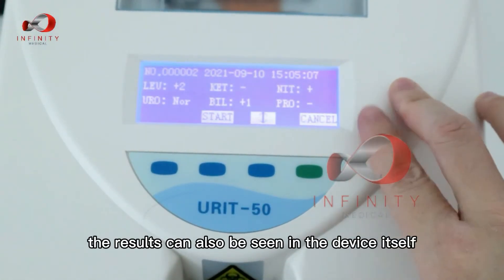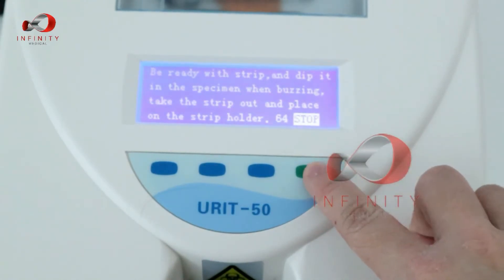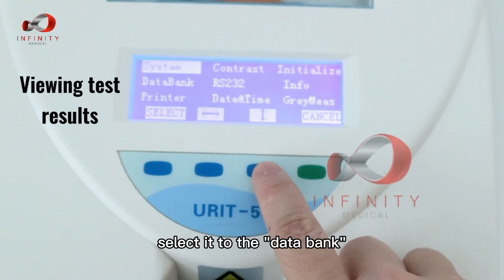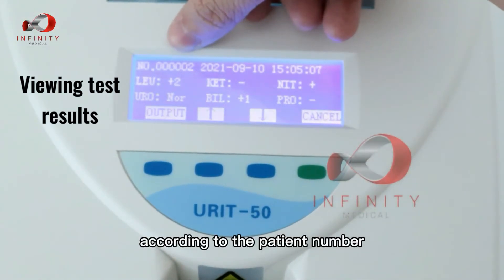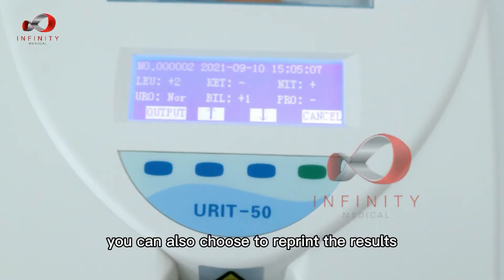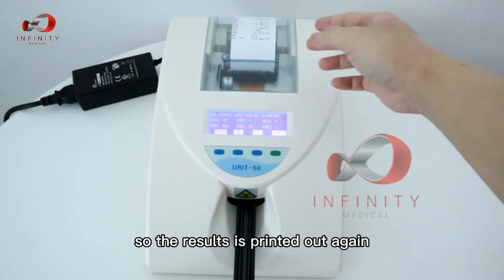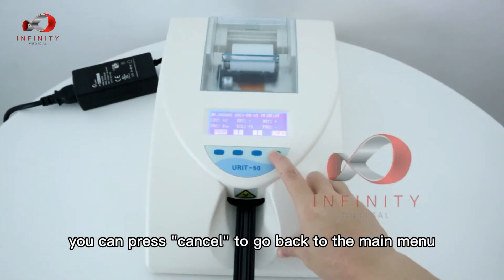The results can also be viewed on the device itself if they are not printed out. Press Start to begin the next test, or press Cancel to go back to the main menu. To review stored results, press Menu, select it to navigate up, and press Select to view patient results by patient number. You can also reprint results by pressing Output, then Print twice.